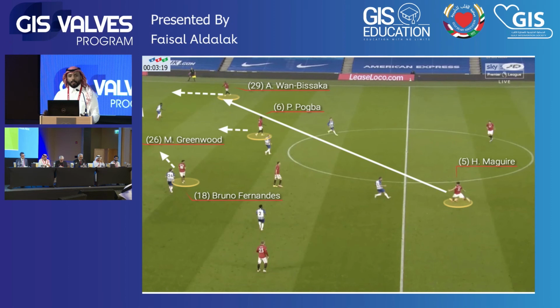So it's always a teamwork between the interventionist and the echocardiographer. You would like to make sure that they follow the same commands. It's a trust. And this is probably one of the interventionists here trying to get a goal.